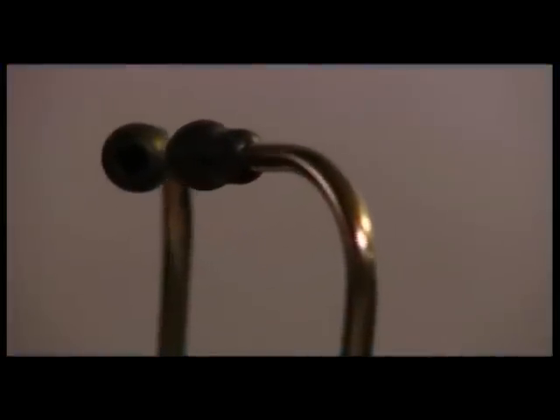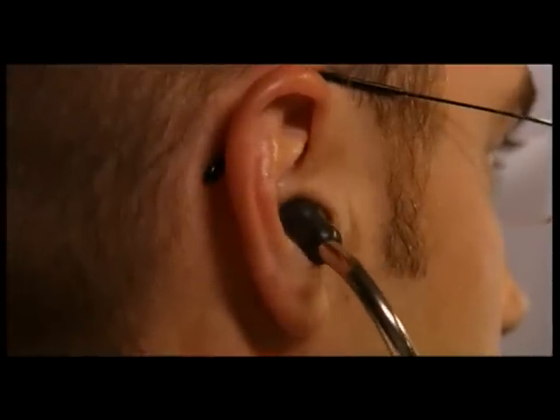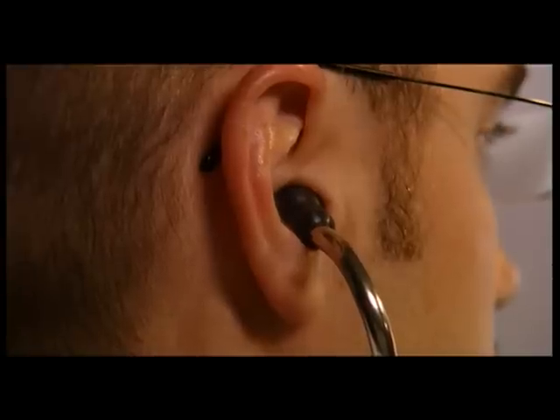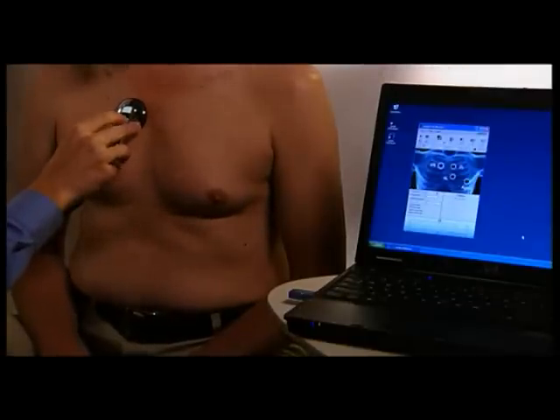A voice prompt in the ear tips of your Littmann Model 3200 stethoscope will talk you through the steps during the recordings. Place the Littmann Model 3200 stethoscope into your ears prior to clicking OK on the setup screen. The first recording is at the patient's 2R, or aortic, site. To start the recording, press the M button on the Littmann Model 3200 stethoscope.